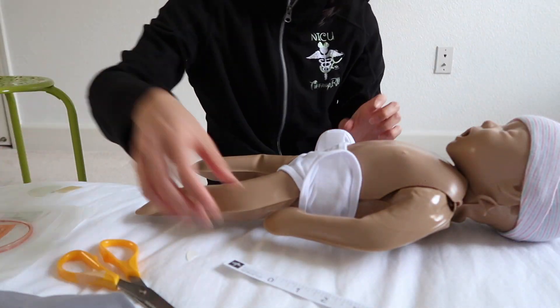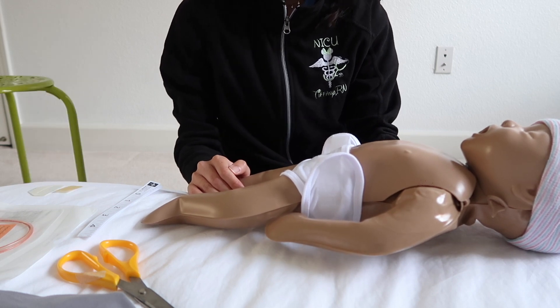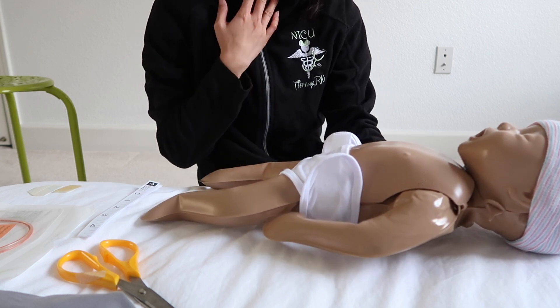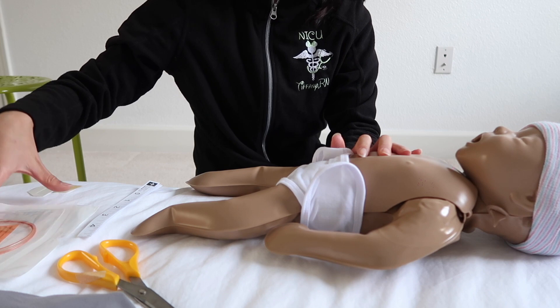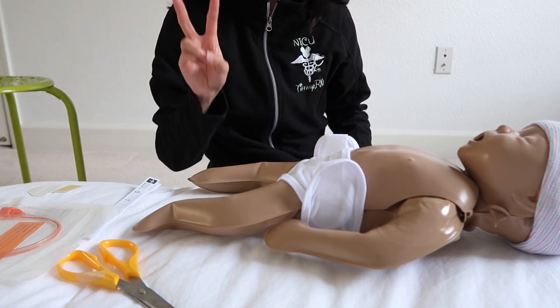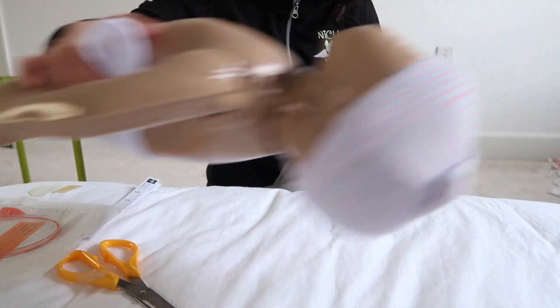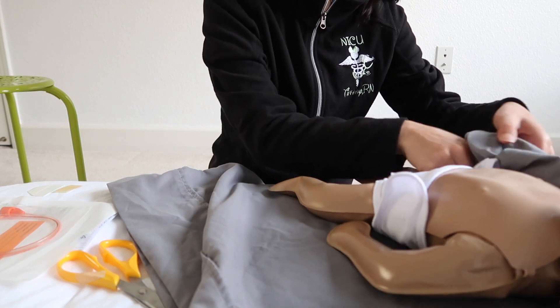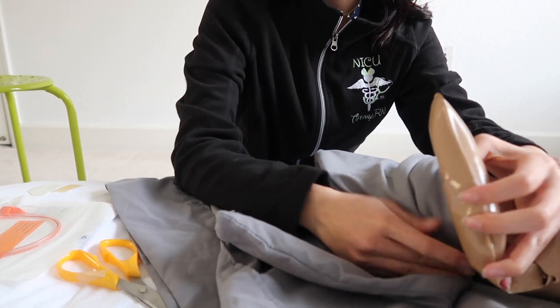For lubrication, I typically like to use sterile water rather than lubricant gel — lubricant is very thick and can clog the back of the baby's throat and is very uncomfortable. I'll dip the end of my OG in some sterile water to get it wet, which helps it slide in easier. First things first: always make sure to swaddle your baby because your baby is going to fight you. Keep the arms tight so they cannot fight you during insertion.